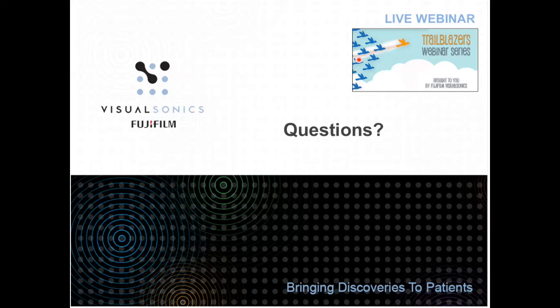Yeah, certainly. Ultrasound and photoacoustics do have great clinical potential. With these high frequencies, you really get very high, crisp resolution on superficial structures. The drawback, obviously, is penetration, but for superficial structures you get real-time images at a very high resolution. Again, it's non-invasive, with a hand-held transducer, etc. Same for photoacoustics. Optical imaging itself is not widely used in the clinic, as you all know.